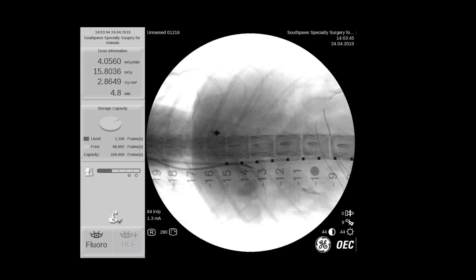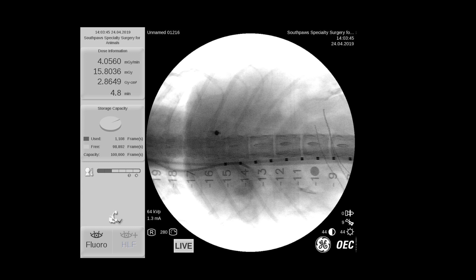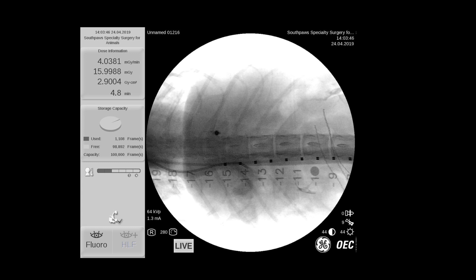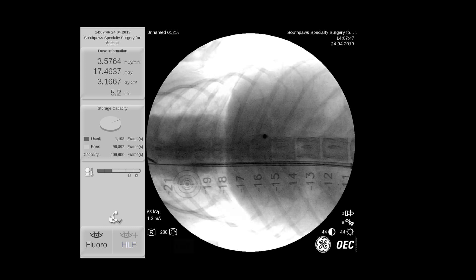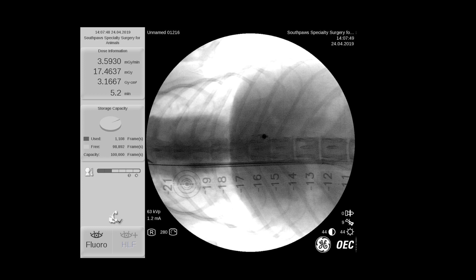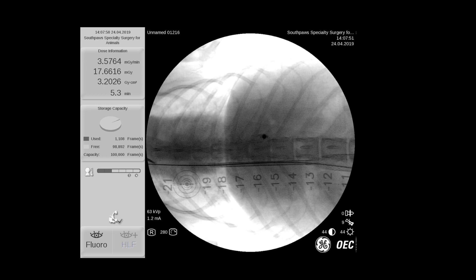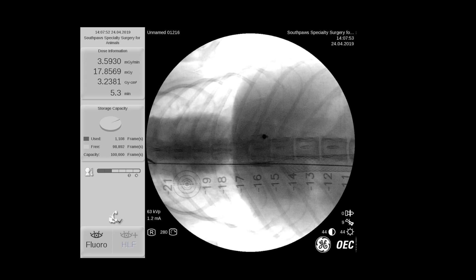In this scan we've put a catheter in the portosystemic shunt and added contrast material and we can see the intrahepatic portosystemic shunt. Now here we're placing an intravascular stent in order to trap the coils within the portosystemic shunt.